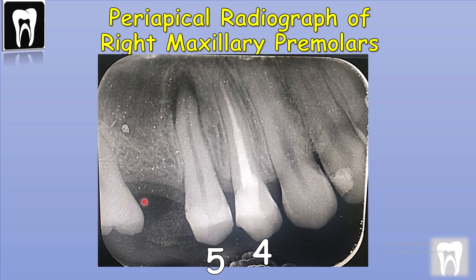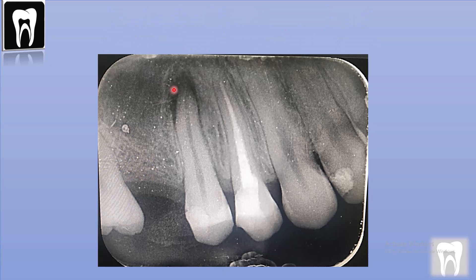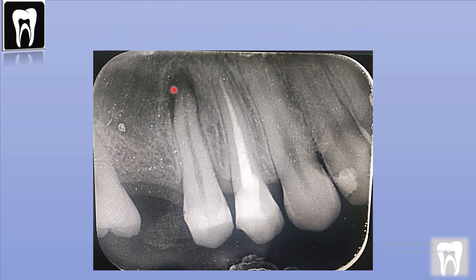Something that is not normal in this radiograph is this periapical radiolucency in the apex of the second premolar. So how did this happen?